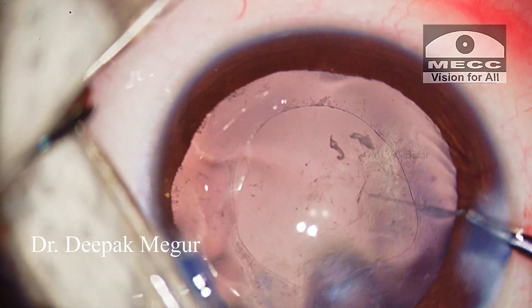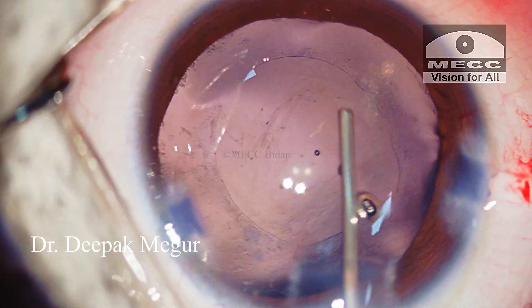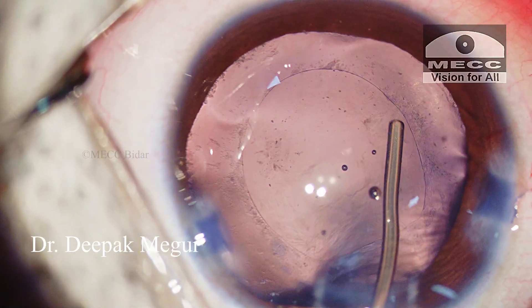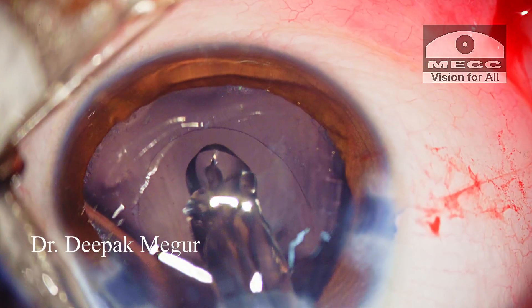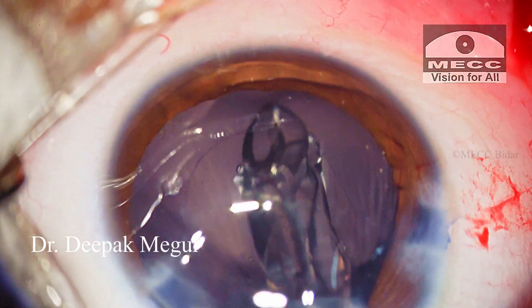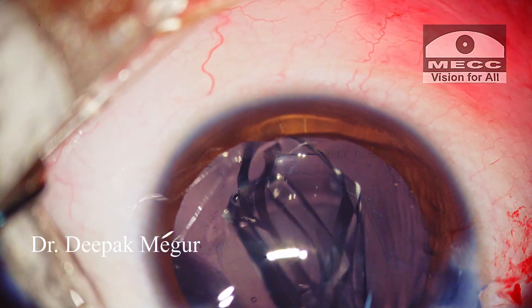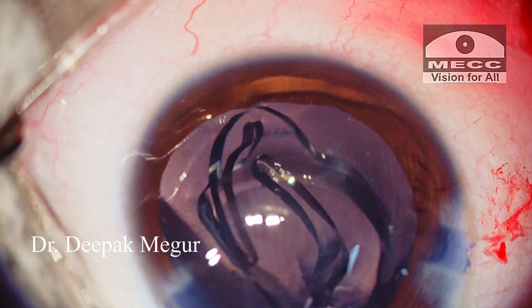And eventually, we have a clear visual axis. After reforming the bag with OVD, the intraocular lens is placed into the bag. This is a single-piece hydrophobic acrylic lens which opens quite gently.